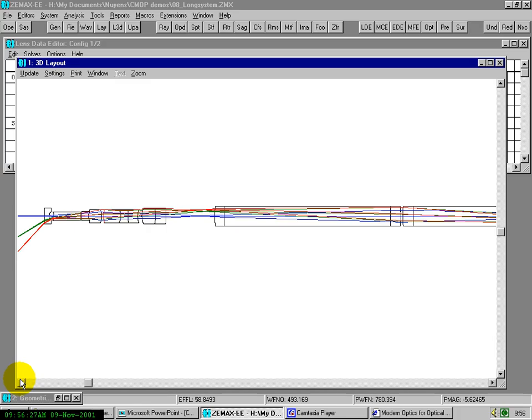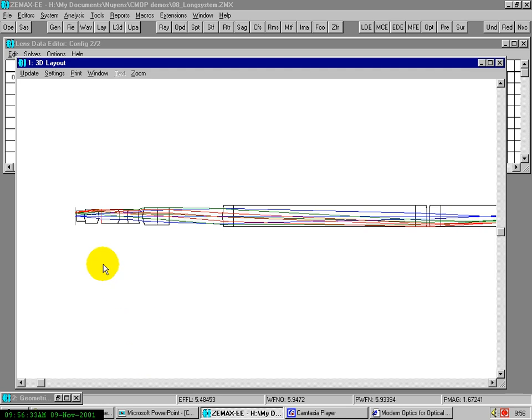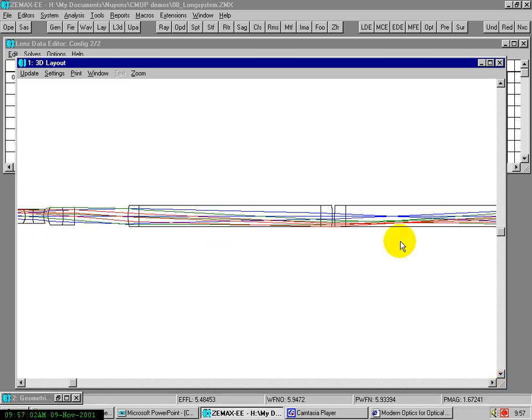So if you go all the way back, and now we go to a slightly different situation. As an exercise, we just put our object at the position where the aperture stop was located, just in front of the doublet. So we consider the aperture stop as an object, and we see where it is imaged. And you see, indeed, somewhere in this area we have an image of the aperture stop, somewhere at the location of the two objective lenses.